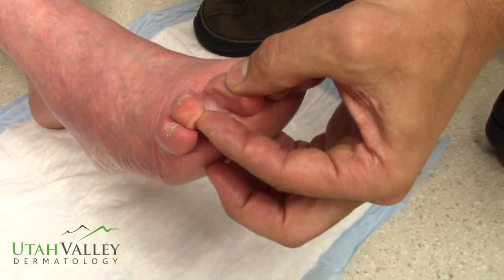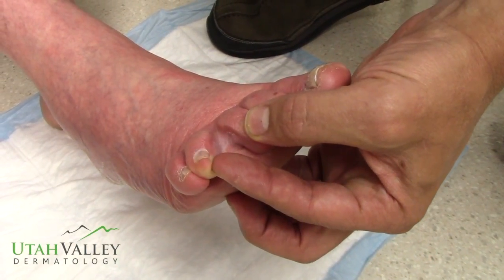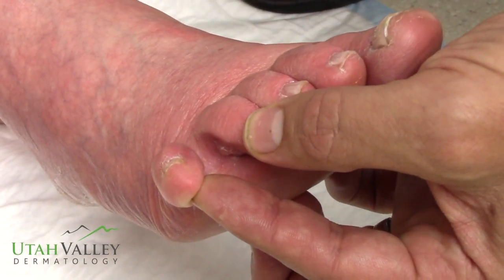With normal light, you can't really see much. Sometimes you can see a little bit of maceration of the toe web spaces, but watch this.